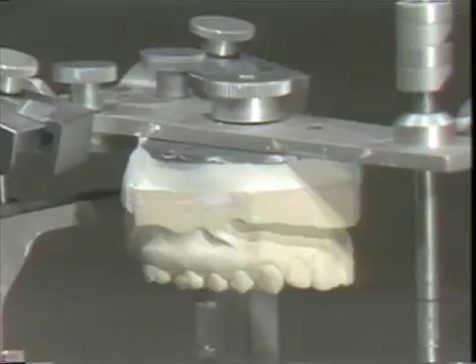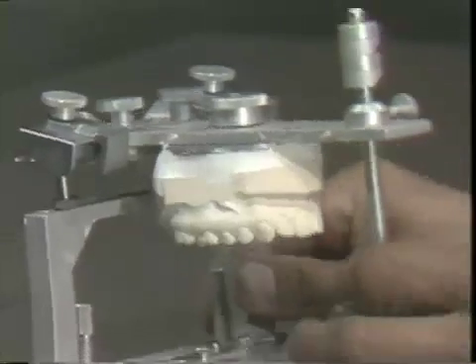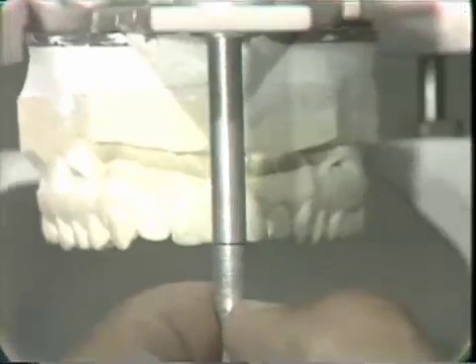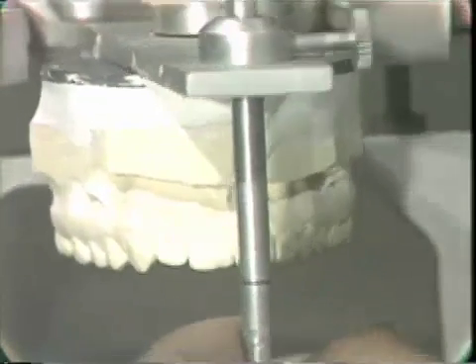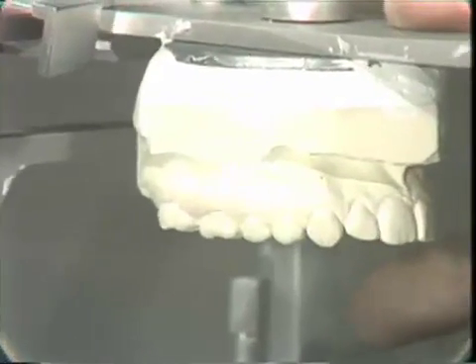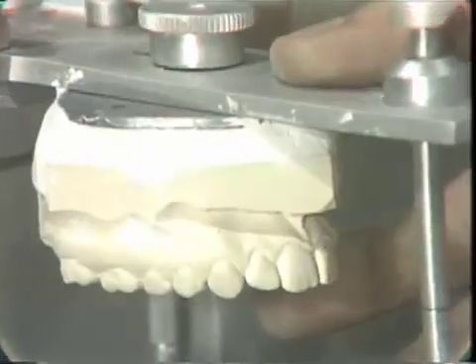The upper cast is now correctly luted to the upper member. If we look at this head on, we will notice that the incisal edges are just about on the black line. When viewed from the side, the occlusal plane is just about level or slightly tilted downward in its inclination.